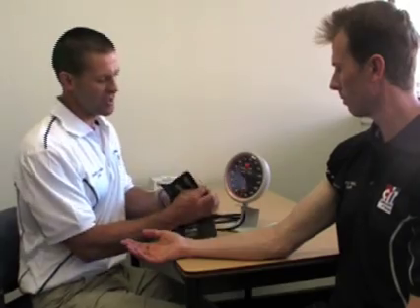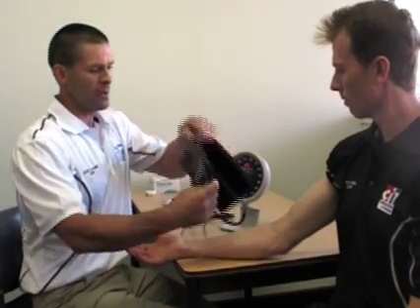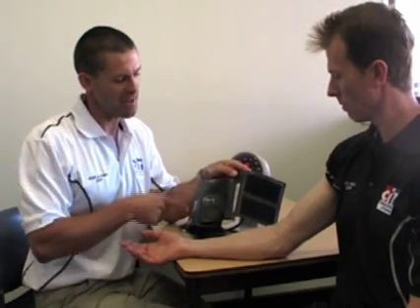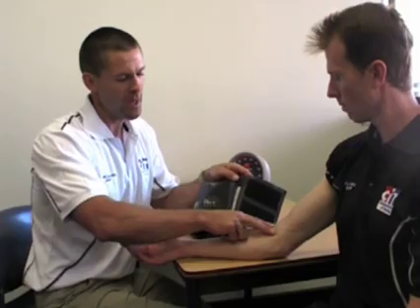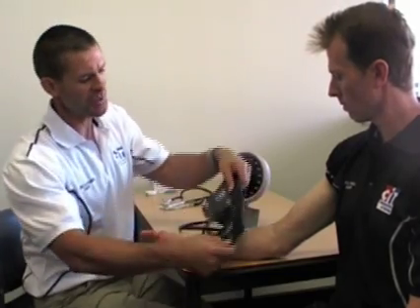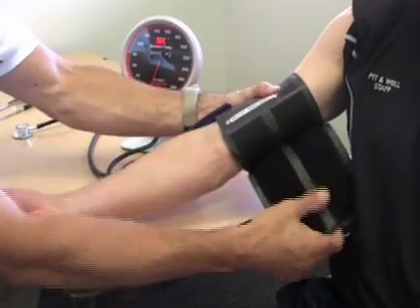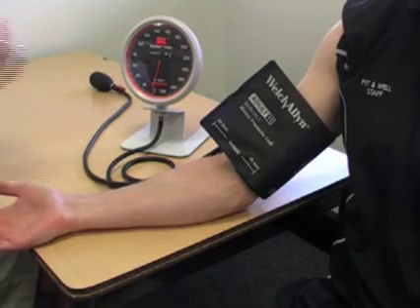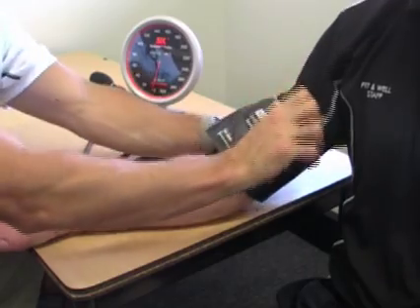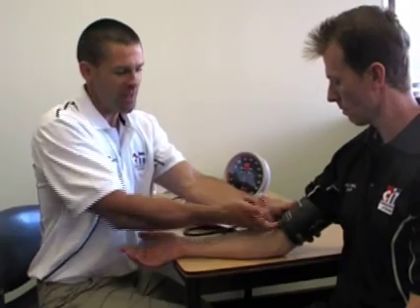Once the sleeve is rolled up, undo the cuff and apply it to the arm. On this cuff, and on just about all sphygmomanometer cuffs, there is an artery index marker. This marker points down to the arteries where you listen to the pulse, which is in line with the bicep muscle. Line up the artery index marker on the arm, roll the cuff around, and attach it. Make sure the cuff is not too tight or too loose — if your finger fits underneath comfortably, the tightness is correct.